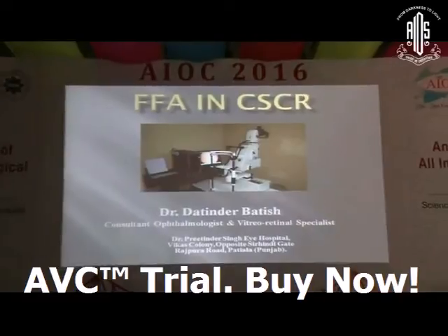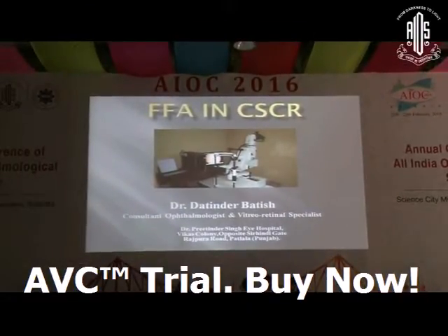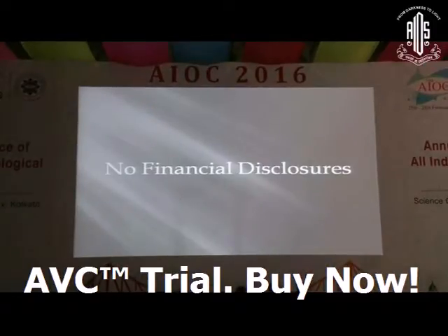I will be talking on fundus fluorescein angiography patterns in central serous retinopathy cases. I have no financial interests.